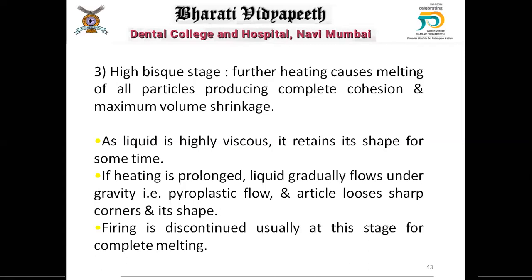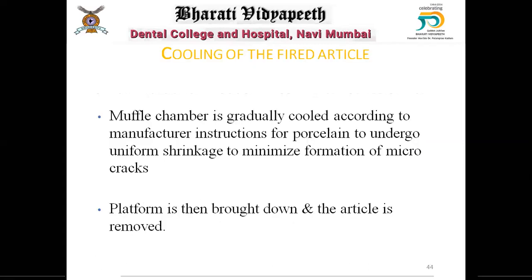So firing is discontinued at this stage, and it is gradually allowed to cool. Once the cycle completes, the heating comes down and it is allowed to cool gradually. The temperature is extremely high, somewhere around 900 degrees Celsius, and you cannot touch the restoration or pick it up and put it in water directly because it might cause fracture of the ceramic. Sudden temperature change might distort the restoration, cause fractures, or weaken it. So it has to be cooled gradually, and the manufacturer's instructions are to be followed.